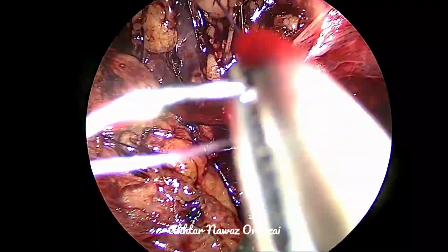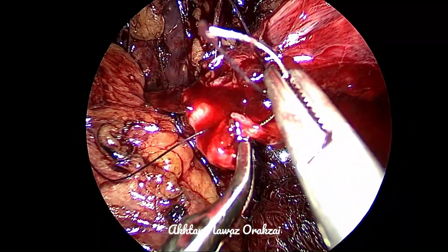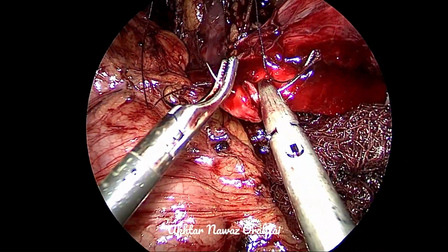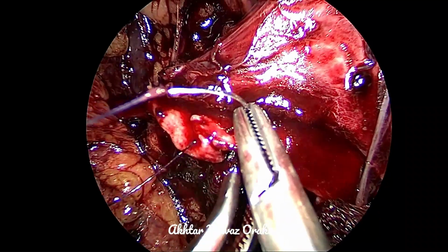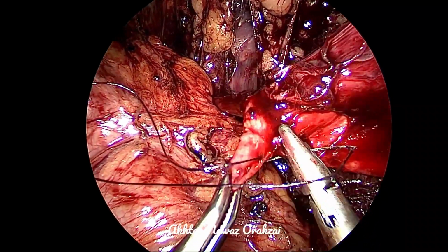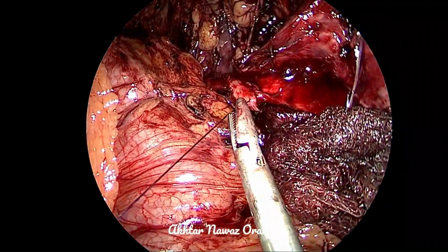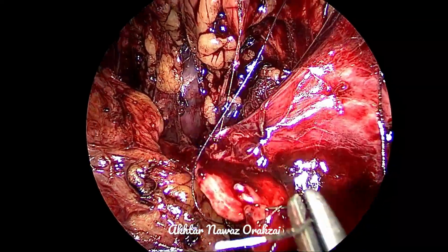The pelvis gets its supply from the kidney, which is very vascular, but the proximal ureter, after dismembering, the blood supply can be compromised. So mobilization of the ureter has to be in a fashion that it is not denuded completely of the periureteral sheath, which contains the vessels running parallel to the ureter, and they ensure the vascularity.